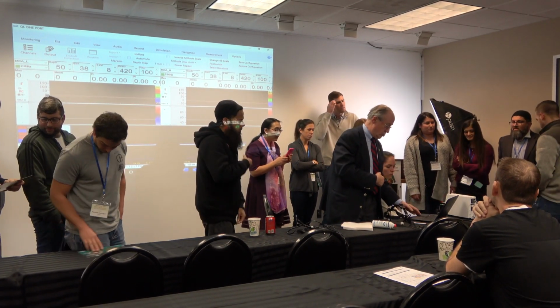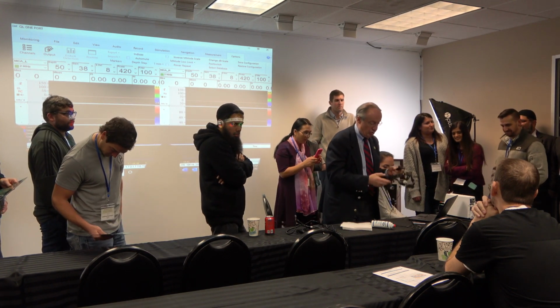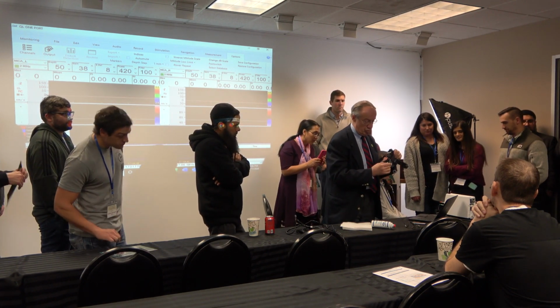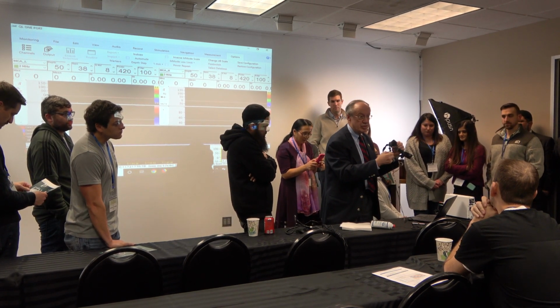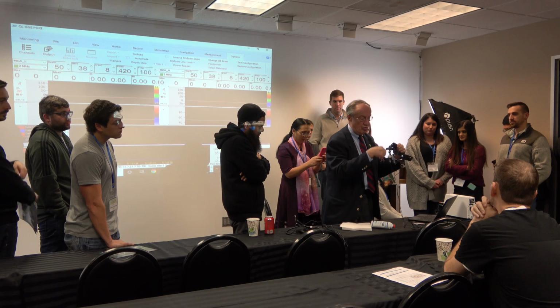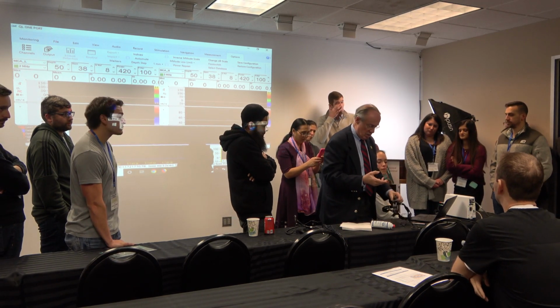You connect the box with a laptop, the software, and then you have the probe holder, with so-called low-profile probes that are actually moving in any direction, as you can see. All right, we can move up, down, left, right.